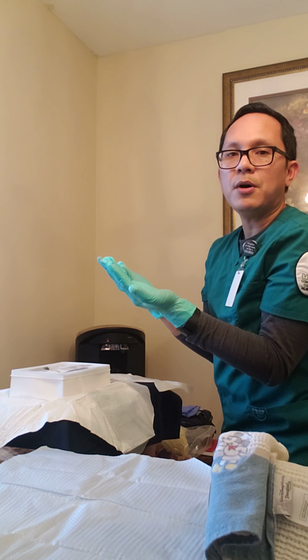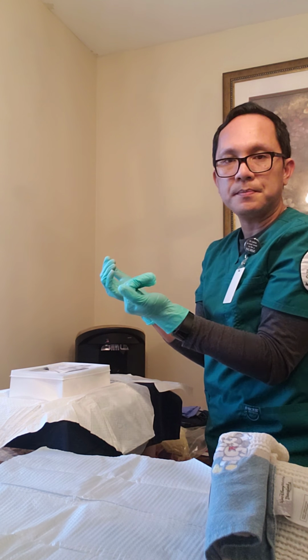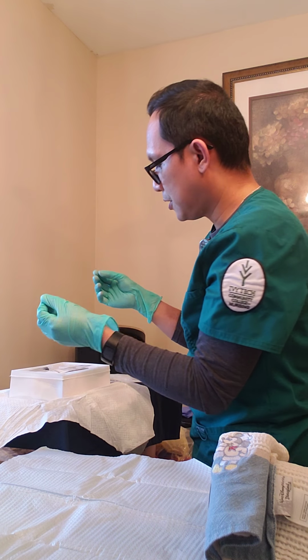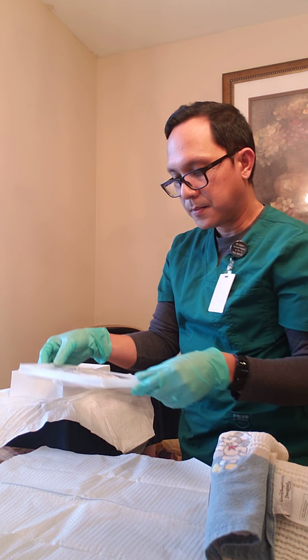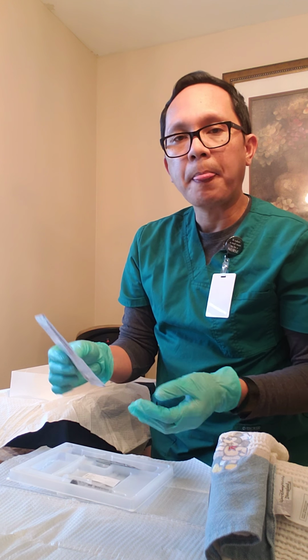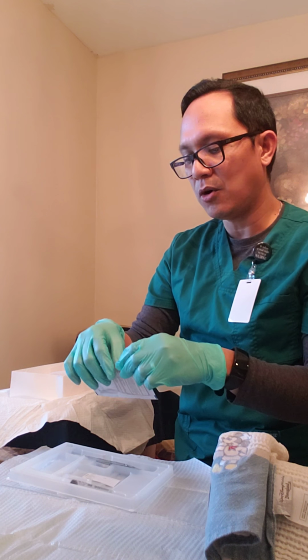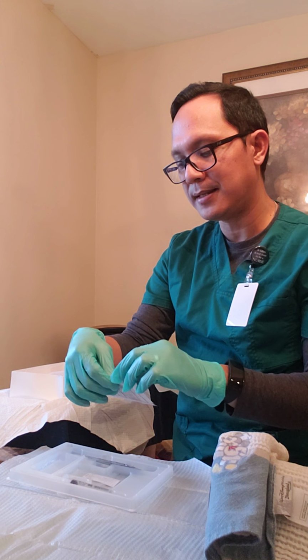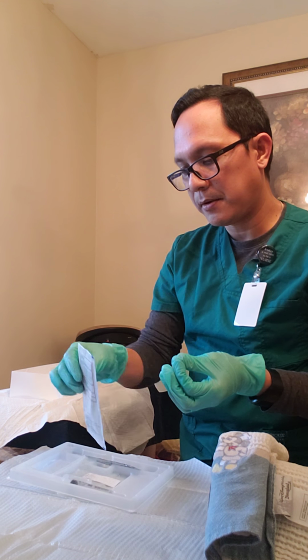Okay, once I've all gloved, we're ready now to do the Foley insertion. I have here the betadine solution. It comes in swab sticks, so I'm just going to open it, pretending I open it. This is what I'm going to be using to clean the perineal area.